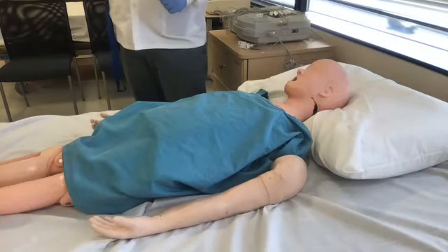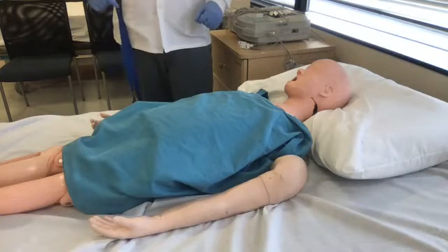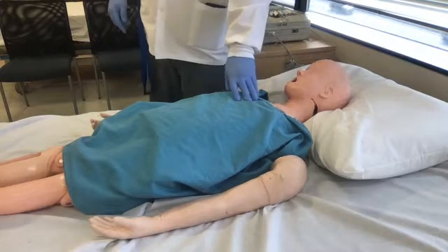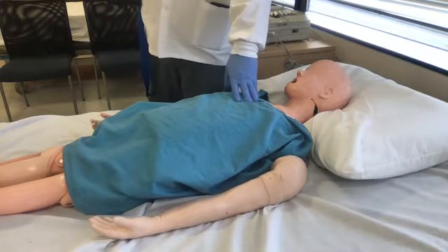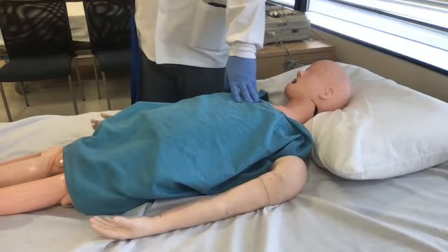It'll actually monitor the electricity of your heart and tell us if there's anything going on with your heart. Is that all right with you? The second he nods his head and he goes, yeah, sure. Did you see in that brief 20 seconds, I not only properly identified my patient, I now identified myself.